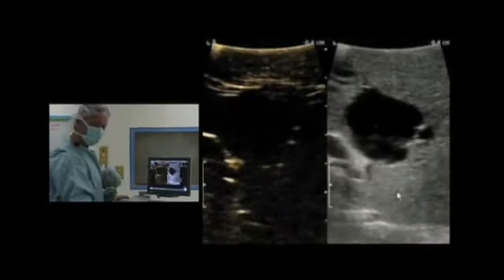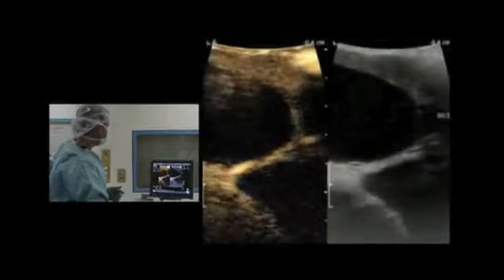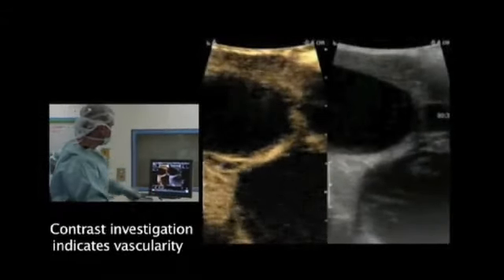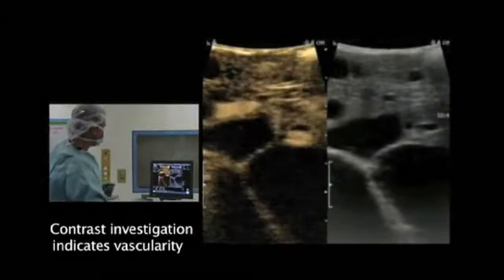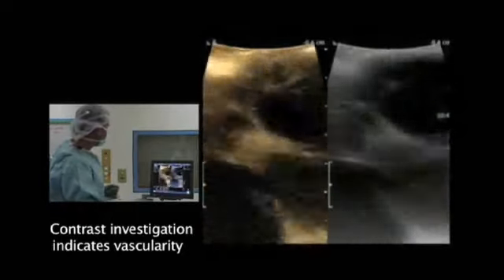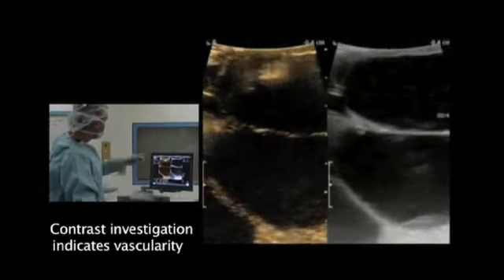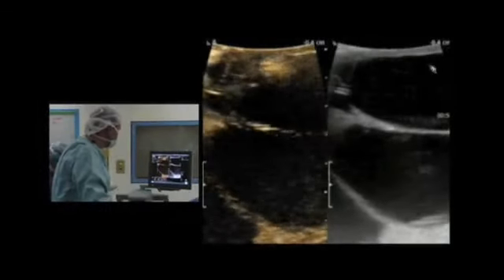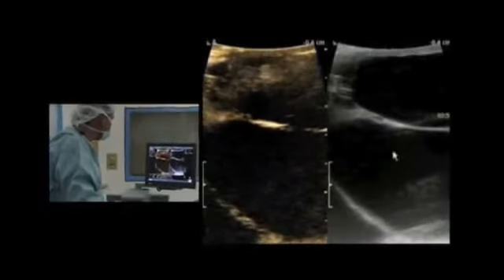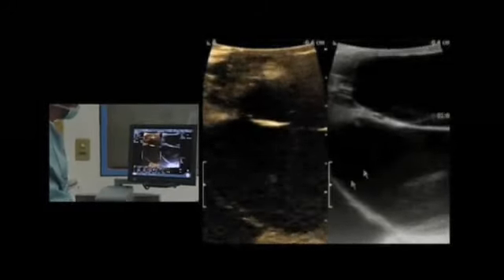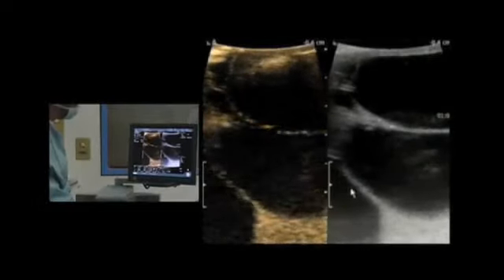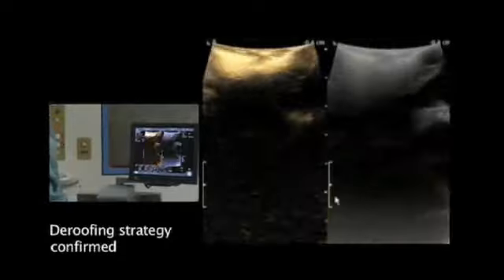Now we can see the contrast is appearing. The cysts will, of course, remain dark without any flow. Now we can see the vascular structures, and this is why I also want to evaluate the structures of the septa. For instance, between here we have to acknowledge that there is actually a vascular structure between these two. On the other hand, between these two, there is not a vascular structure. So again, it can provide us quite important information. Here we have the cysts as we planned to make the de-roofing at, and we can see that there is no vascular structures inside this area. There is maybe one here, which we can also see corresponding here.